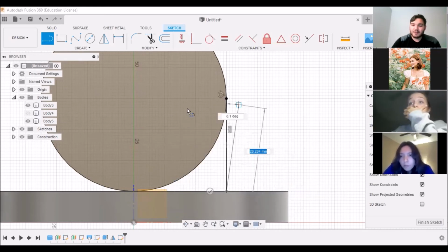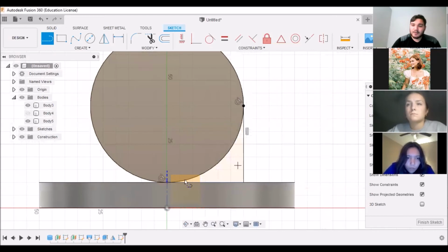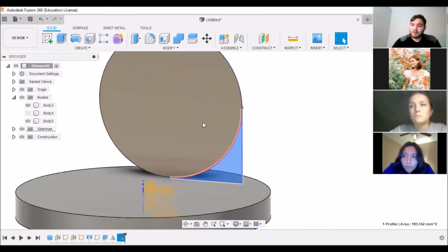Now, it should still be trying to put a point somewhere, so we can take that line and connect it to the bottom of the cap. And what that does is create this little curved edge and exits you out of the line tool. So we can finish sketch from here. What this does is it used the original sketch circumference from our circle as one of the edges of this little bendy triangle, I guess. Then we had our right angle, and it establishes its own little sketch plane.